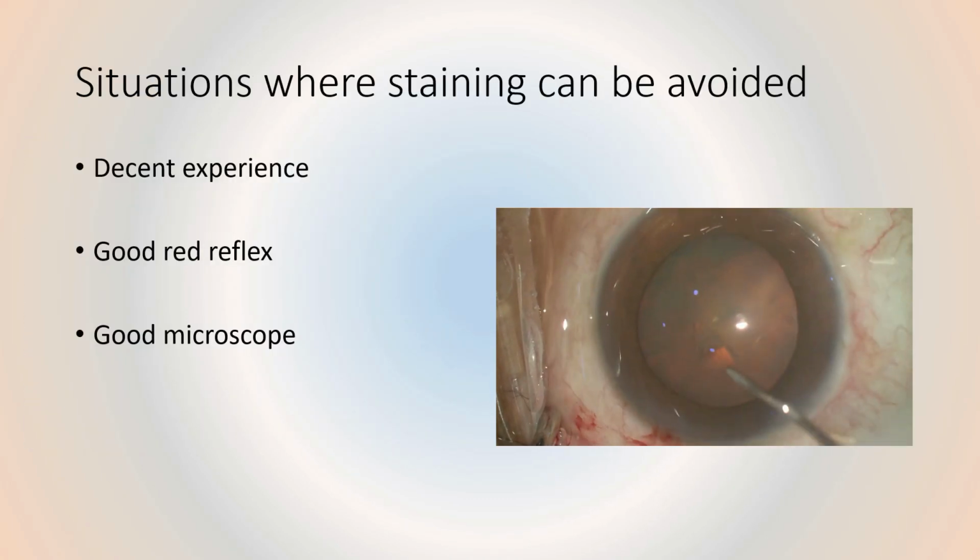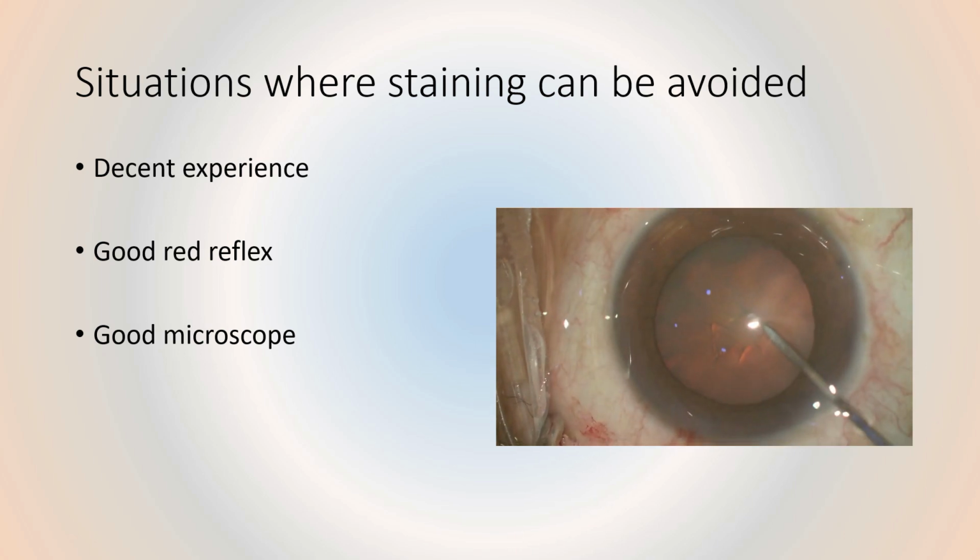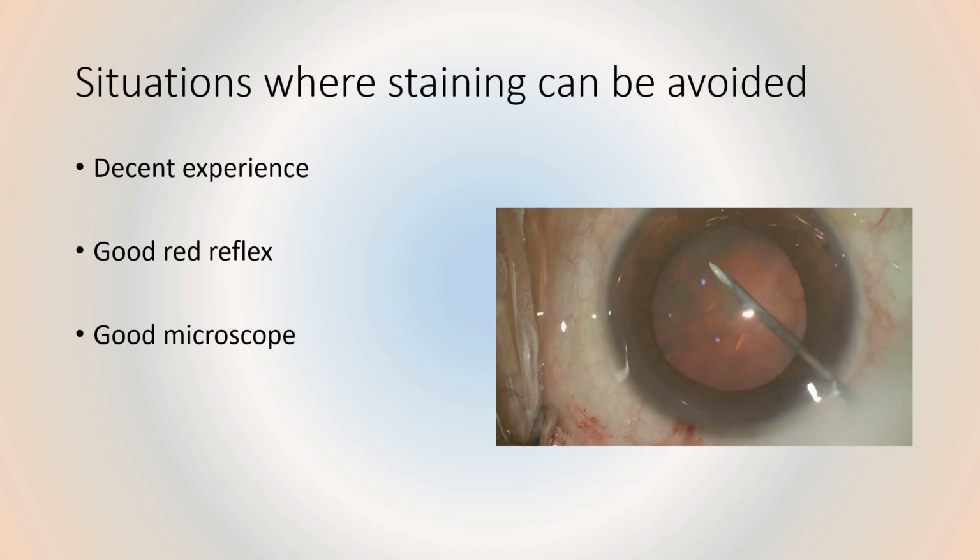Situations where staining can be avoided: decent surgical experience, good red reflex, and a good microscope.